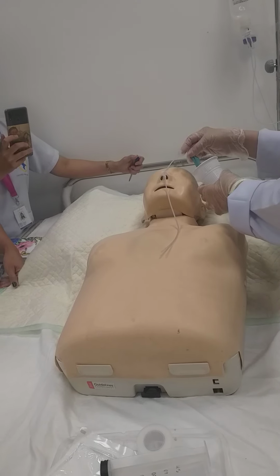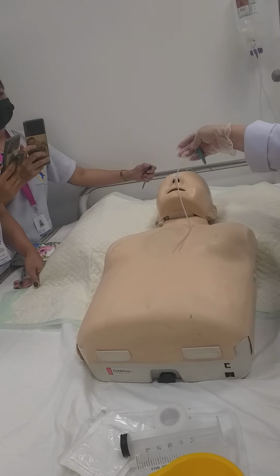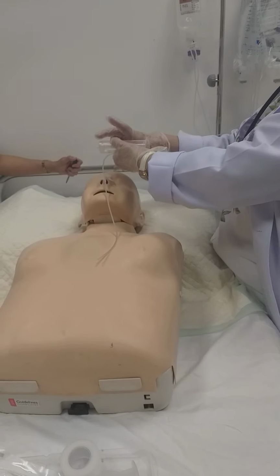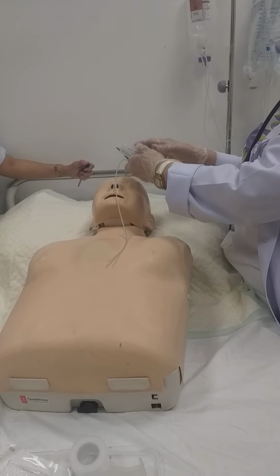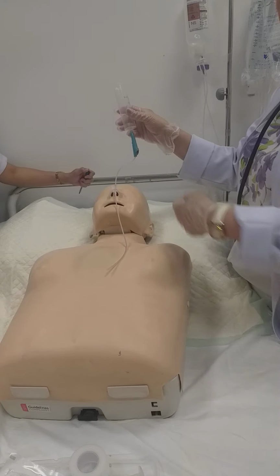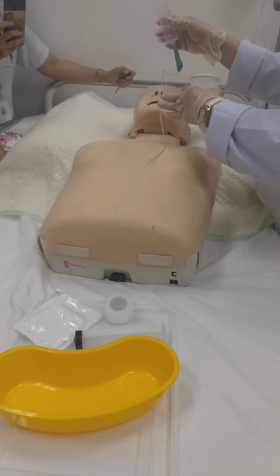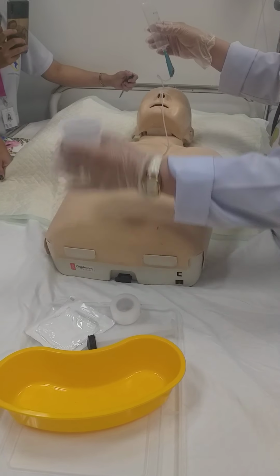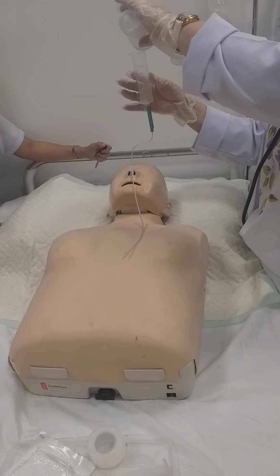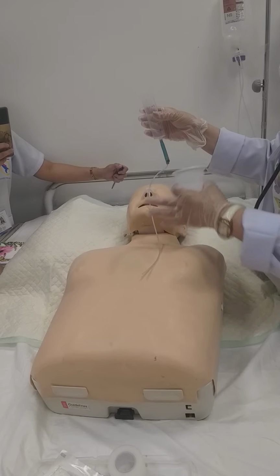Okay? So, if there are no bubbles, proceed. Pinch, close. So, we will proceed now. We will start feeding. Before and after starting the feeding, we will flush with water. So, connect. Get your water. We already have that already, right? Okay. So, we will put 30 ml. 30 only. 30 to 50 of water. To flush means to say, we will check whether it is going in.